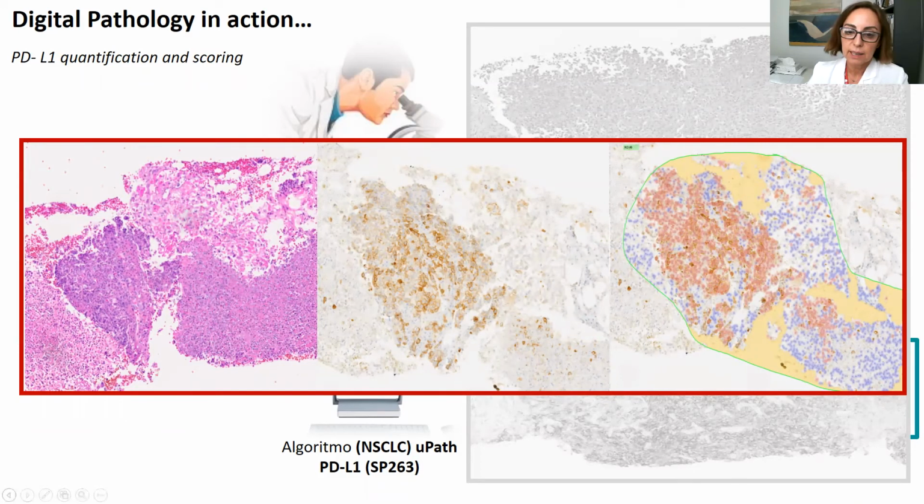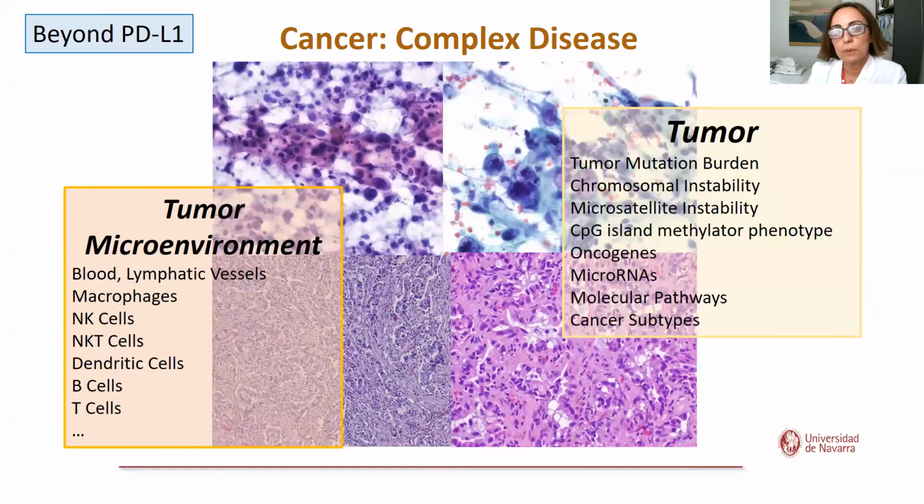And now the new tools, digital pathology, is coming to help us, I think. We are starting a little project using cell blocks and trying to compare the algorithm for PD-L1 with our eye interpretation. We are using this system, the uPath from Roche, and this is a very preliminary study, and we want to finish it and have the opportunity to show it to you at some meeting.